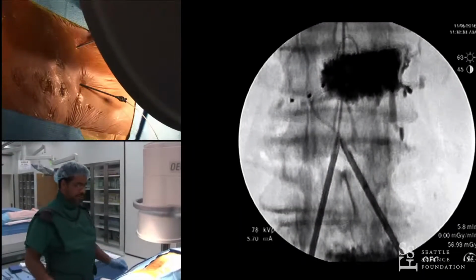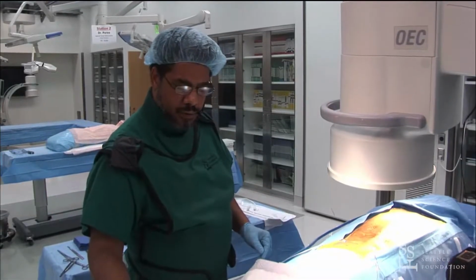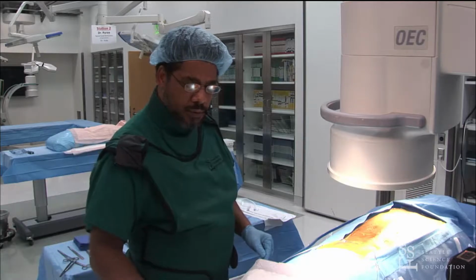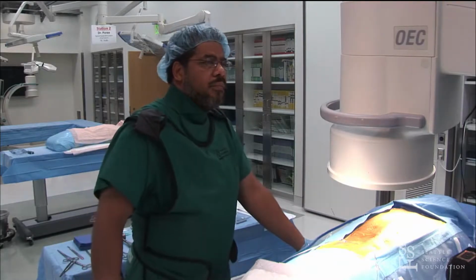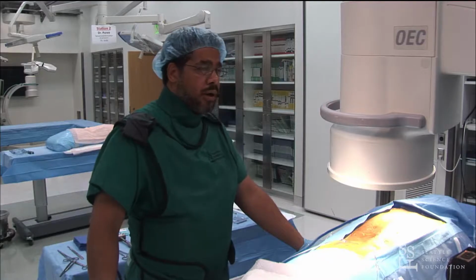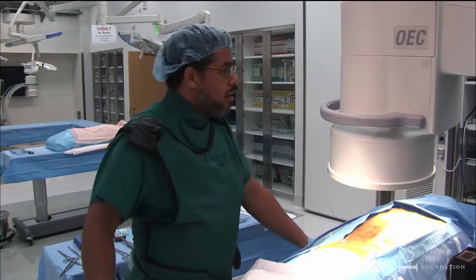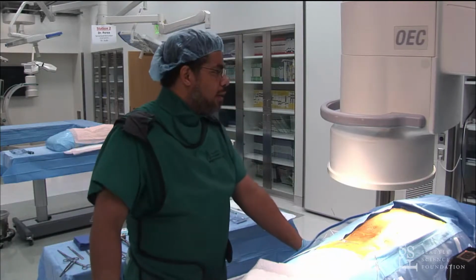Any questions? Questions from the audience? Question is that in comparison to standard configuration trials, with the DRG trial, do I get less migration or more migration than the leads? I'm sorry, to make sure I heard that, more or less migration, you say? Correct. Yeah, it's a migration issue.